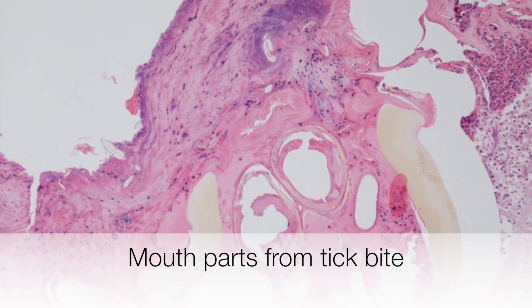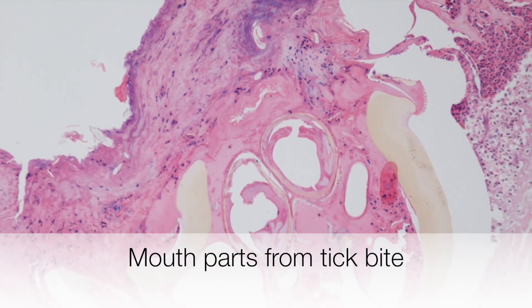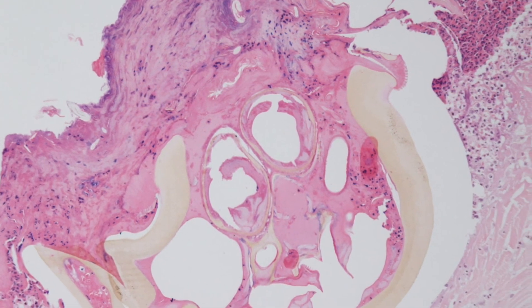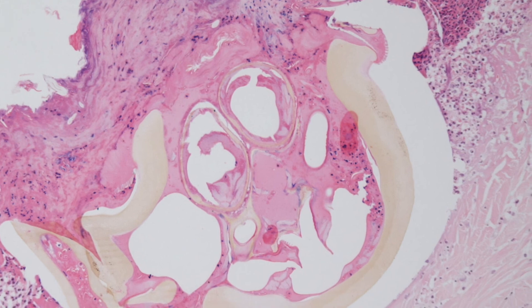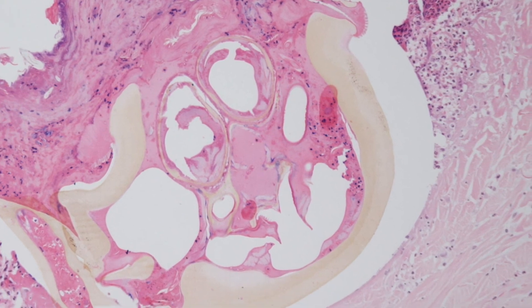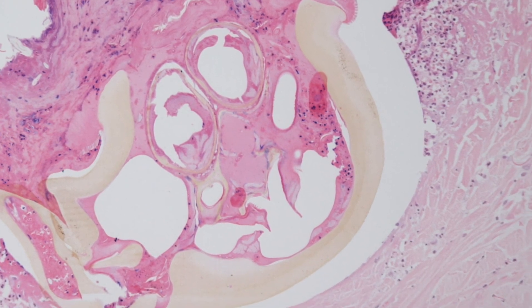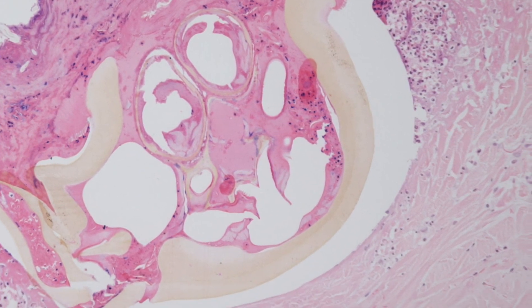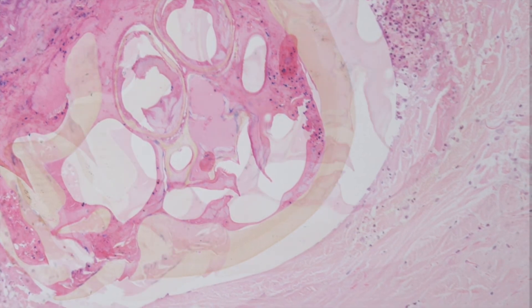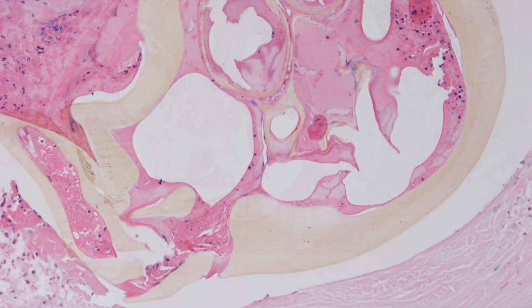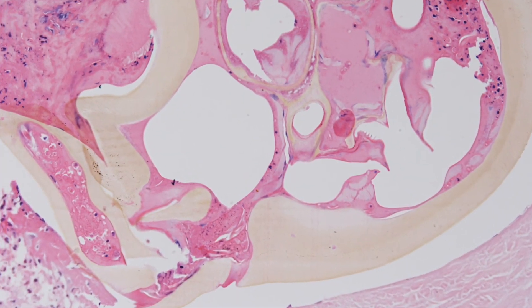Looking at the skin biopsy at a higher power you can see not only is the skin ulcerated and inflamed, but there is a yellow structure and this is the chitin of the exoskeleton of the tick, enabling the diagnosis of a tick bite to be made.